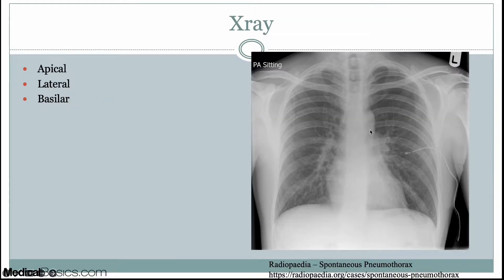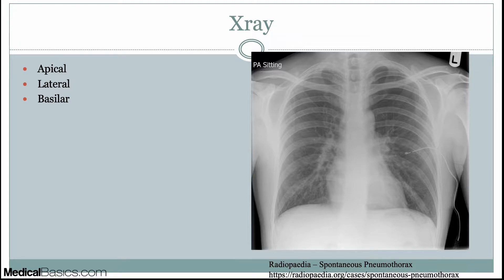Where do you look for them? There are three common areas. It depends on whether the patient is supine or upright. The three areas are the apex, laterally, and the base. When the patient is upright at least 30 degrees, air goes in a non-dependent fashion — up to the top of the lungs. When supine, air usually goes to the base or laterally.